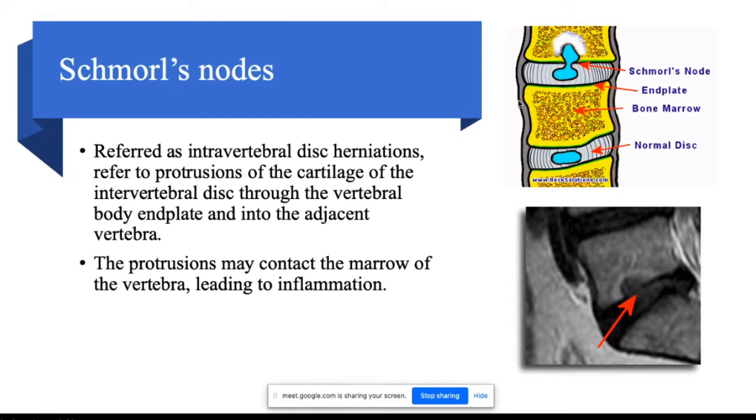cystic lesion, and hence there will be a filling defect. You can see in the next picture, there is a small area where there is a filling defect. That bony appearance is not there. Instead, there is a dark spot. This can be identified in the lateral view of the X-ray if a patient has extreme stages of disc herniation and disc sequestration has already happened. For example, in patients who have a chronic history, when you see the X-ray, you can see some kind of nodes or black spots on the adjacent vertebral bodies. That is suspicious of Schmorl's nodes.